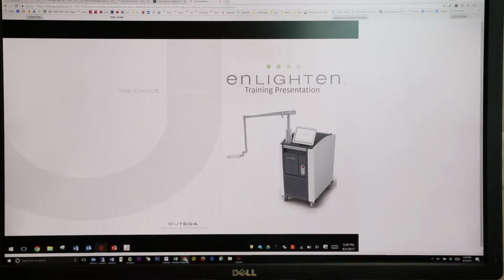You have your Enlighten 3, correct? You have 3 wavelengths. No, we have the Enlighten 2. We have the 2016 Enlighten. Okay, so how many wavelengths do you have? Only 2. You just have the 2? Yes. You have the 532 and the 1064, correct? Yes. To my best knowledge.